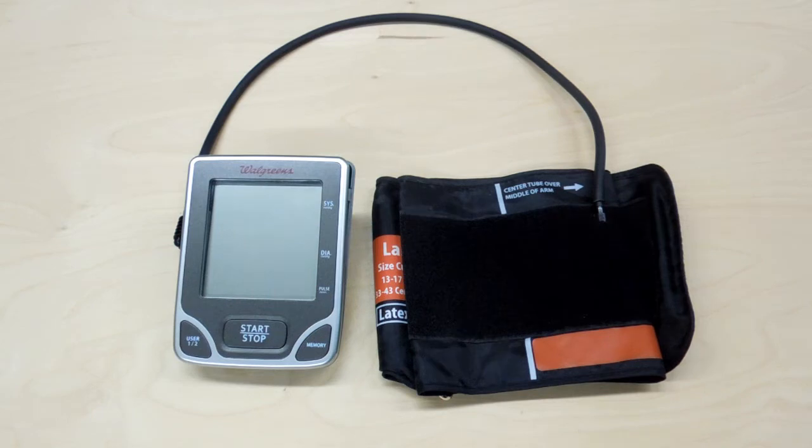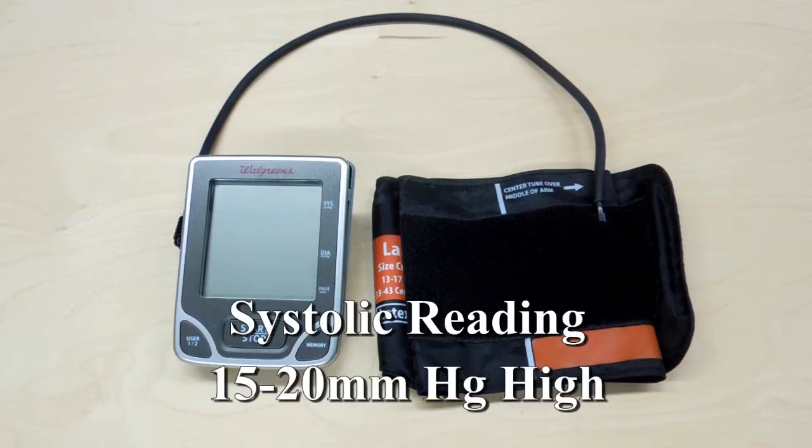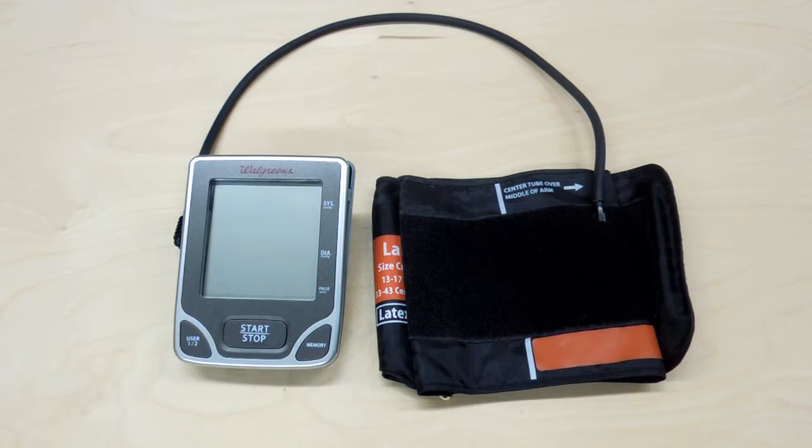This is a Walgreens blood pressure monitor. I took this into my doctor's office a week or so ago and compared it to readings the nurse got using a regular blood pressure cuff. This is reading 15 to 20 high repeatedly, so that makes it pretty useless. I'm going to take it apart and see how it works.